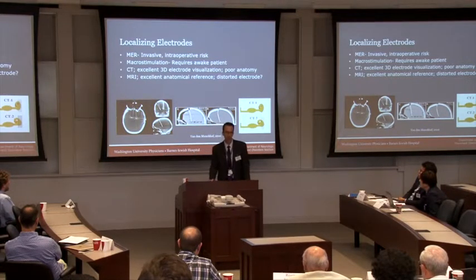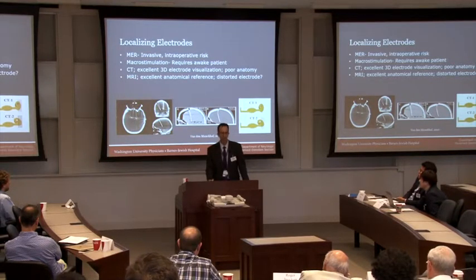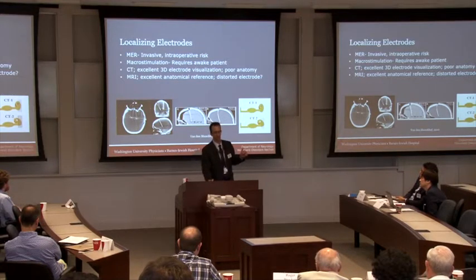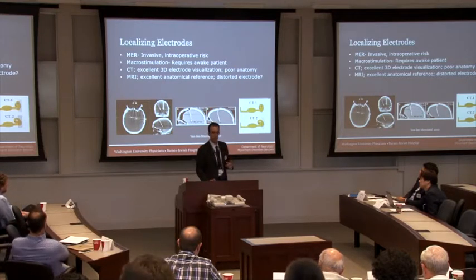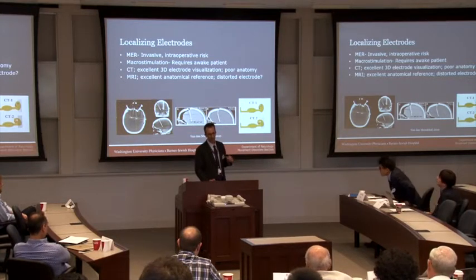Determining how that electrode shifts in relation to the brain and the anatomy that we're targeting is very difficult. It's difficult because of the limitations in the technology we have. CT, X-rays allow us to see the contact tip very well. MRI allows us to see the anatomy very well. Unfortunately, CT does not allow us to see the anatomy. MRI does not allow us to see the contact tip very well. Some people do that, but we're going to argue that there's a significant amount of unpredictable artifact that occurs when you place metal into an MRI. And so precisely determining where that contact is very challenging.